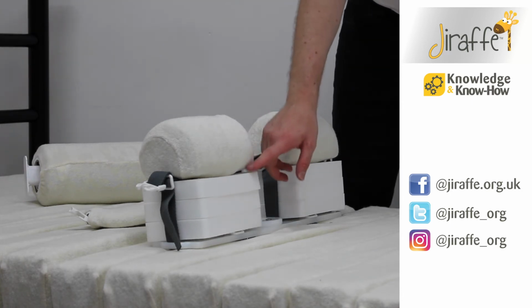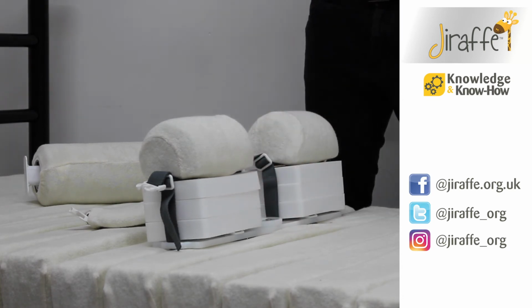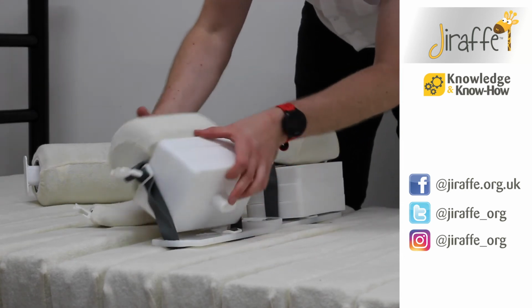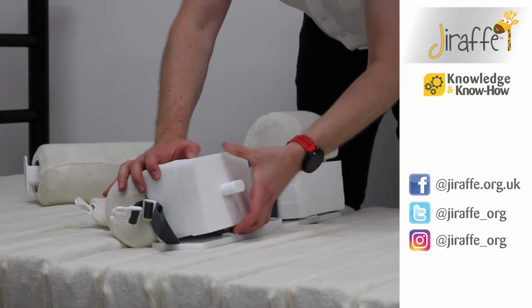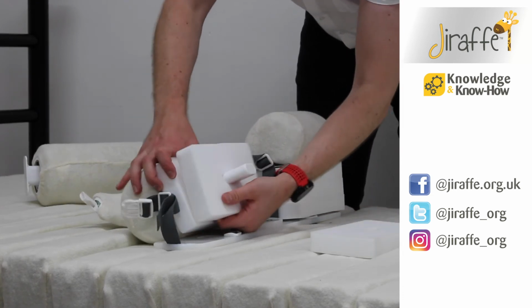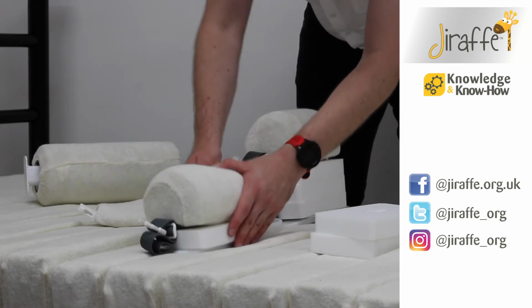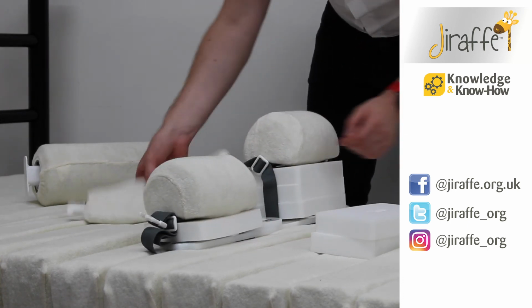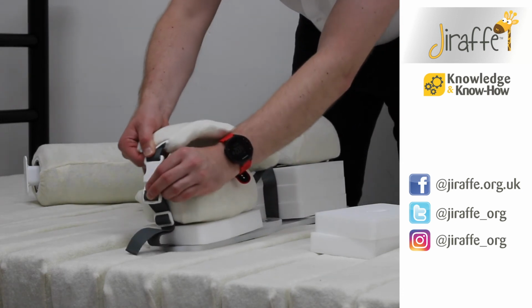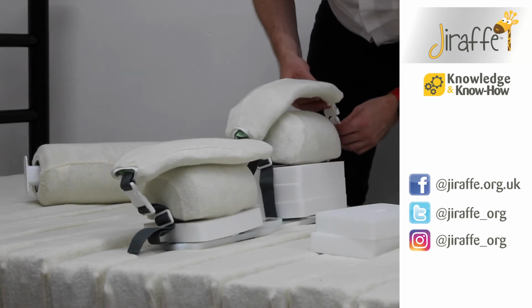As you can see, we have 3 foam blocks here to support any flexion we might have. If we need to adjust those, we can simply lift and then remove as many foam blocks that have to be removed, and then reinsert into place. We can then strap the knees back in just to support them in place.